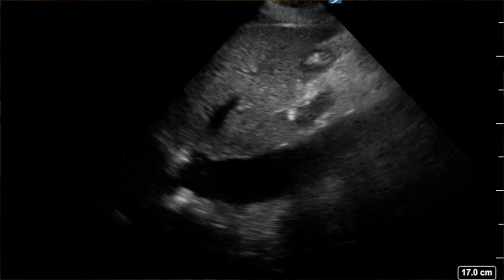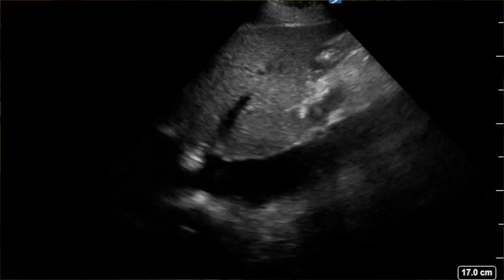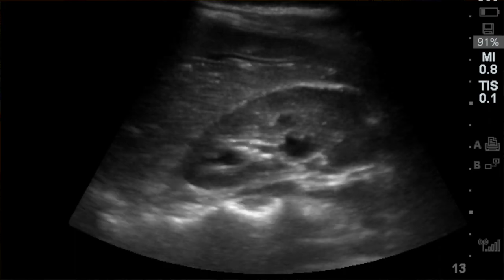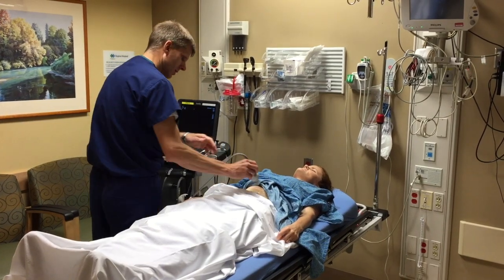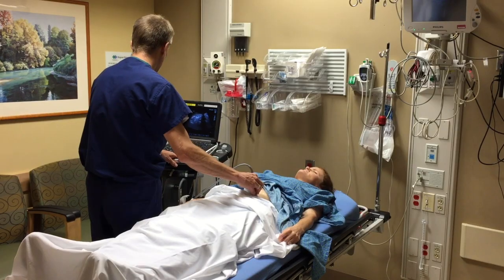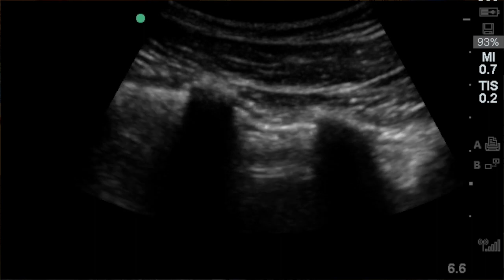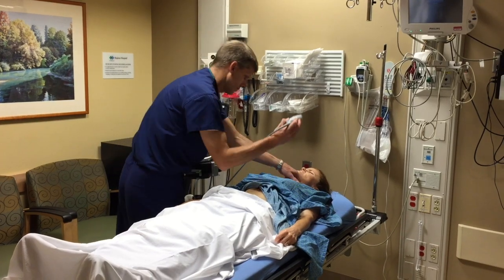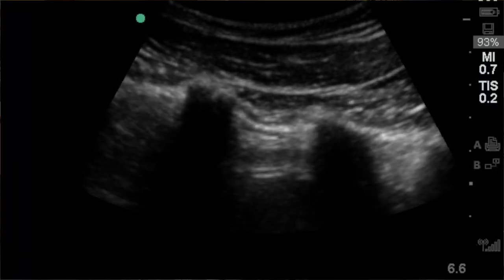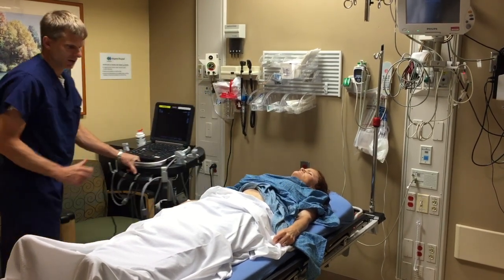Take a look at the IVC — that's pretty dilated. I think we probably know what's going on, but let's finish it out. Quick look at Morrison's: no free fluid. Aorta looks real normal. Quick look at lungs for pneumothorax — great sliding on both sides. So we have pericardial effusion and tamponade. Let's prep for a pericardiocentesis and get some aggressive fluids going.